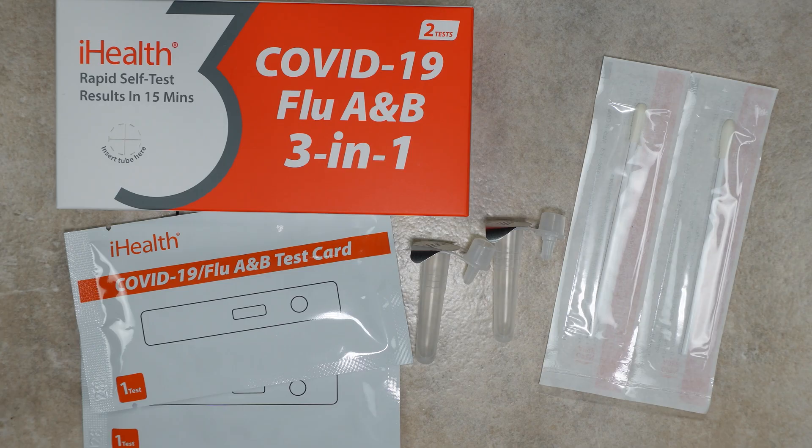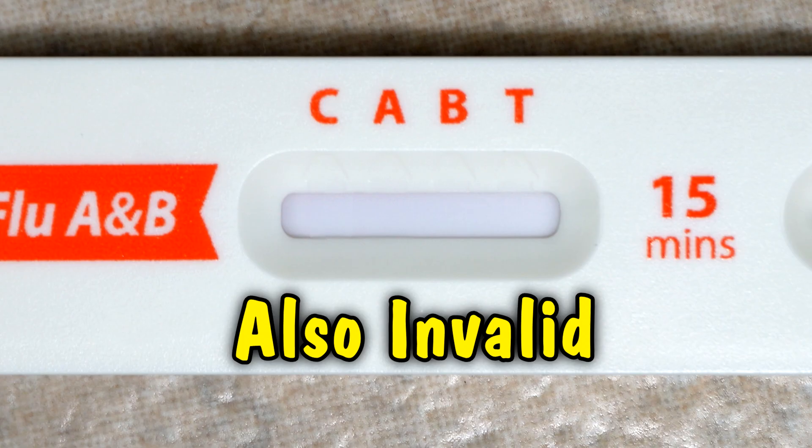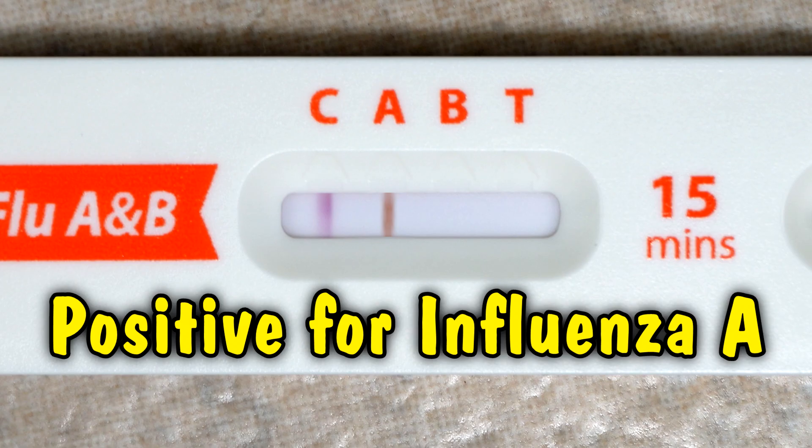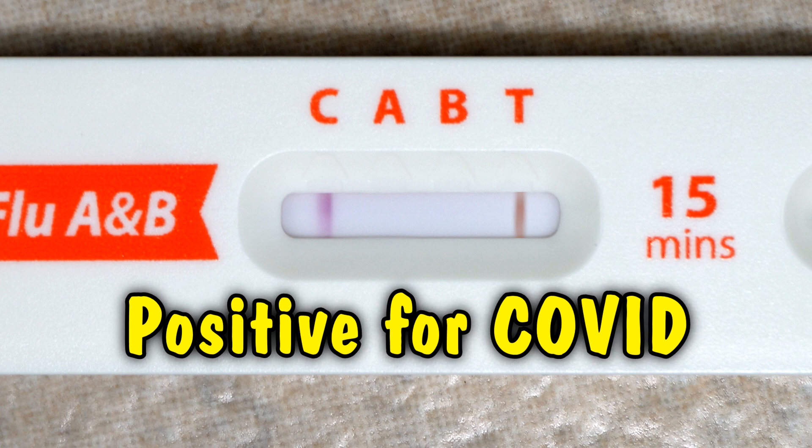You have to have a new tube, a new swab, and a new test card. It's also invalid if there are no lines at all. So as long as you have a line next to your C, you need to look at the other three spaces. The A is for Influenza A, B is for Influenza B, and T is for COVID. So if you have a line underneath A, it has detected Influenza A in your sample. If you have a line under B, it has detected Influenza B. If it has a line under T, it has detected COVID in your sample.